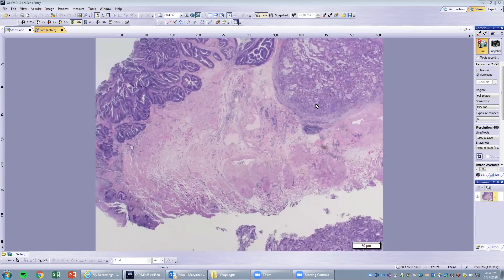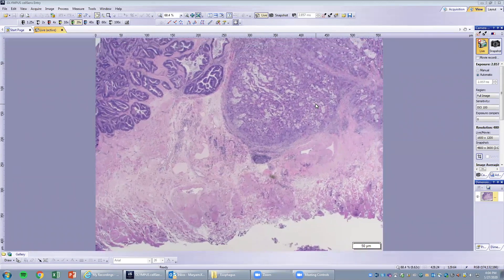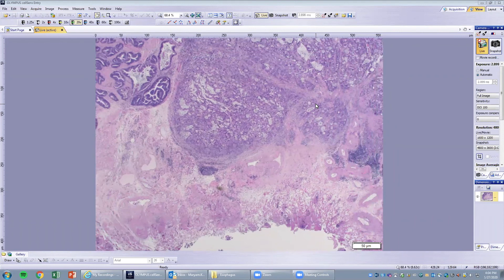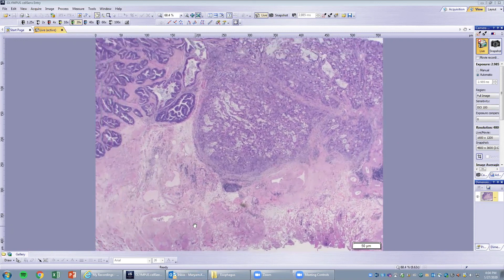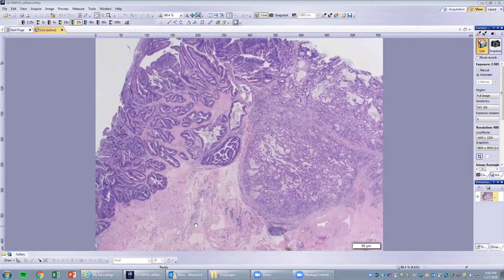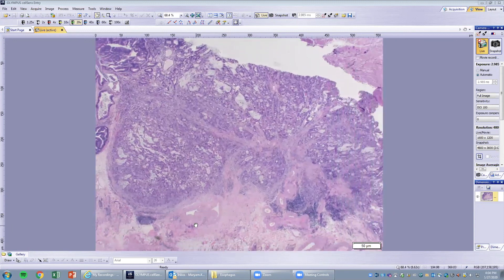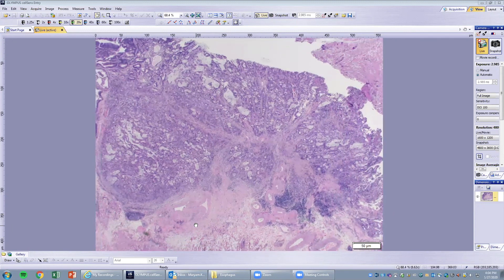As you can see, this is our deep margin, which is negative for tumor. This is an example that Barrett's esophagus can become cancerous, demonstrating the importance of monitoring and treating dysplasia when identified.